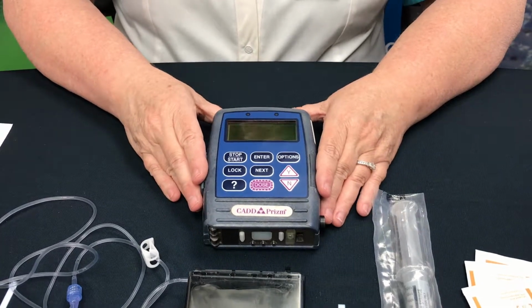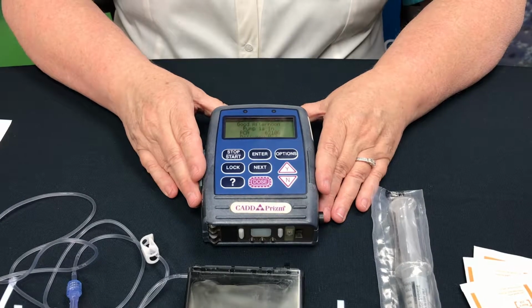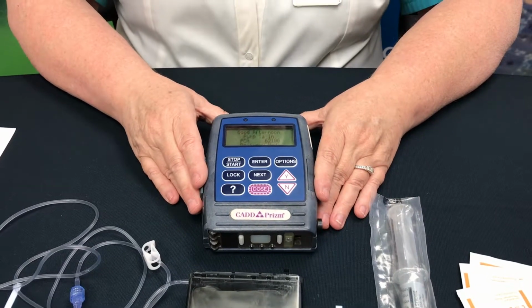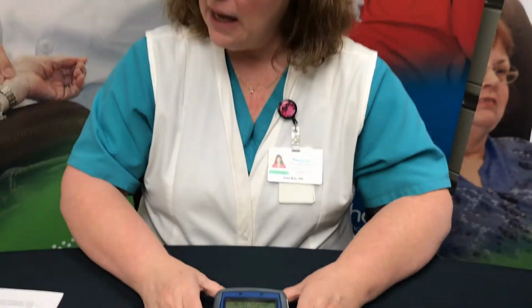As far as the pain pump goes, your doctor will normally order a basal rate, which is a number of milligrams that will be given hourly. That will be a continuous infusion. And then you will also be given a demand dose. A demand dose is a number of milligrams that you will be able to be given on an intermittent basis.